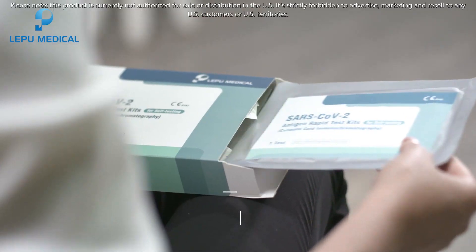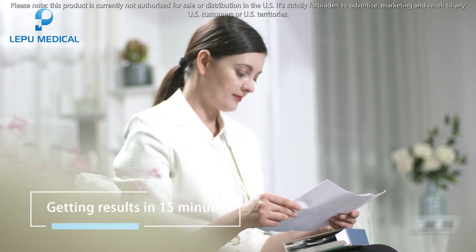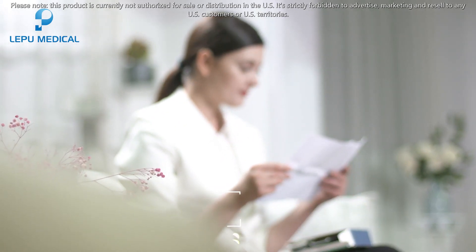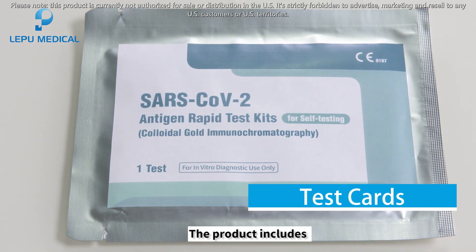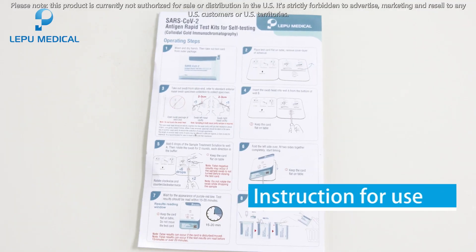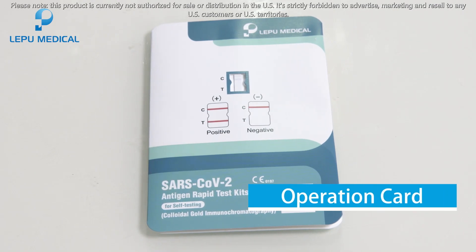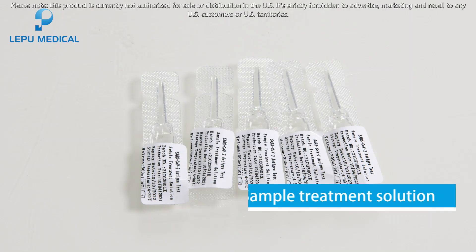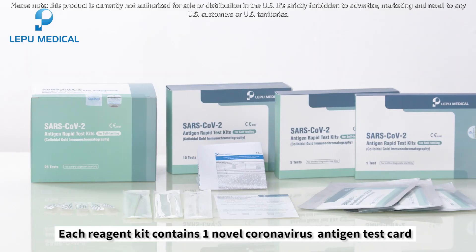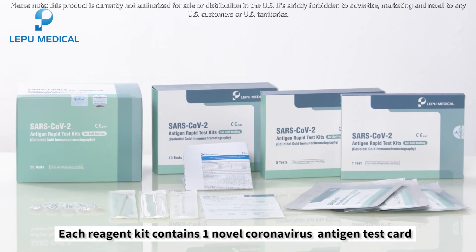It is simple to use, no prescription needed, getting results in 15 minutes, stable with high accuracy. The product includes test cards, instructions for use, an operation card, disposable sterile swabs, and sample treatment solution. Each reagent kit contains one novel coronavirus antigen test card.